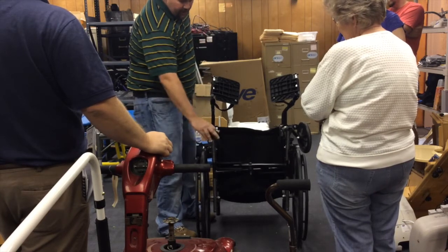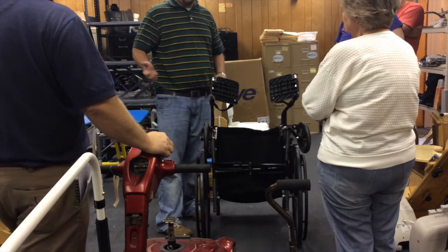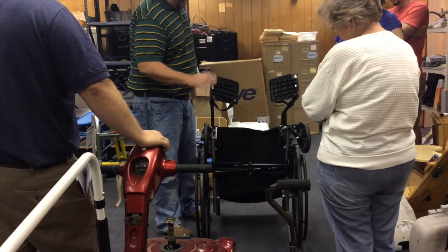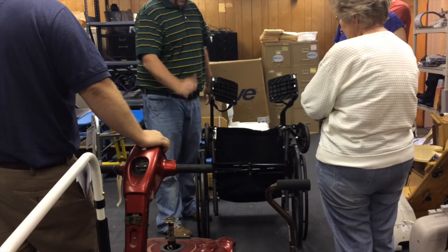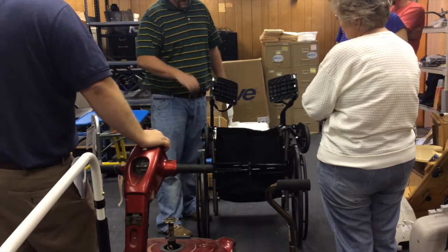If there is movement, grinding, or if it's hanging, go ahead and pull it apart. Spray it with some WD-40, put some grease on it, put it back together, see if that works. This chair's frame is broke, so I would suggest taking the legs off, taking the wheels off, putting them in your reuse pile, and throwing the rest of it away.